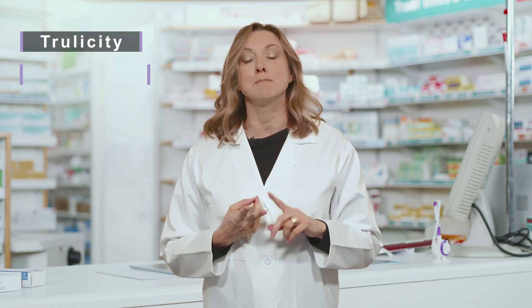Newer medications to help treat diabetes — the ones that work with your body to help it release its own insulin — come in a pen with a preset dose and with the needle already attached. Some examples of these pens are Trulicity and Mounjaro.